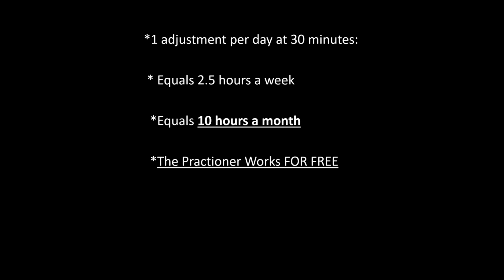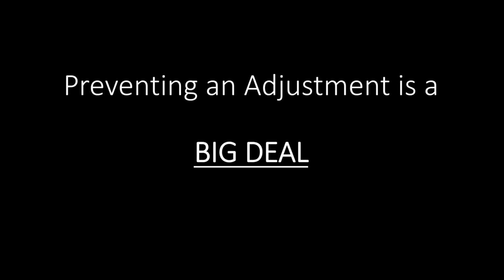So what did I show you? Well, we've got a chew cycle, we have freedom in centric, move your articulator differently, start trying to set teeth with and function within a chew cycle, and start using freedom in centric denture teeth. And I named the brands that have it. And now you start using that and you watch the acceptance level go up because the thing fits better in the architecture of the person's mouth. And you're happier because you're less stressed because you're not dealing with the big deal of the adjustments.